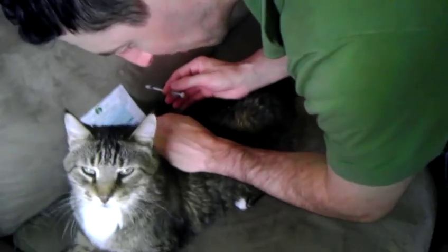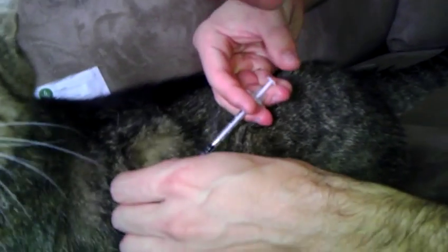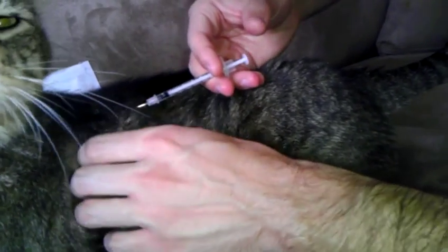Bring him over to the couch. Come on Peanut. That's a good boy. Pet him a couple times. He's going to lay down. And then on his left side here, find a nice soft piece of skin to pull up, usually towards the front — it's a little bit easier. Pop it in. That's good. And that's it.